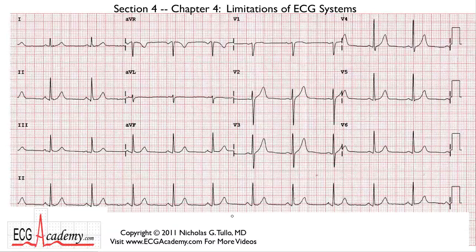Going to finish up Section 4 with Chapter 4, Limitations of ECG Systems. Now, what does that mean? Well, we're going to talk about what can go wrong when you're recording an ECG and how to make sure that what you're looking at is real.